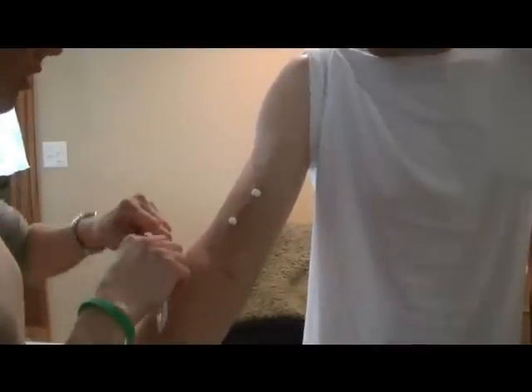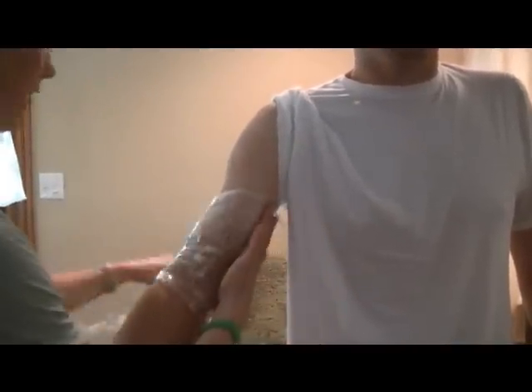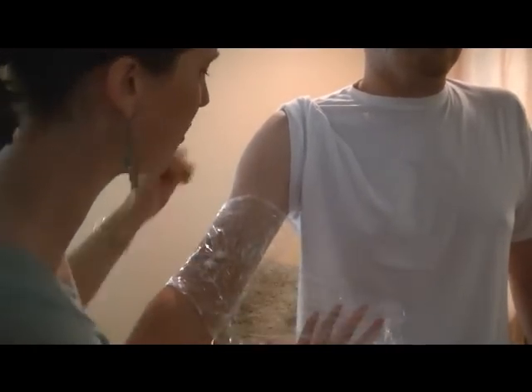First we put on this lidocaine cream and it has to set for 45 minutes so that it doesn't hurt as bad whenever we put the needles in. We wrap it in saran wrap and let it wait for 45 minutes while we set the machine and everything up.